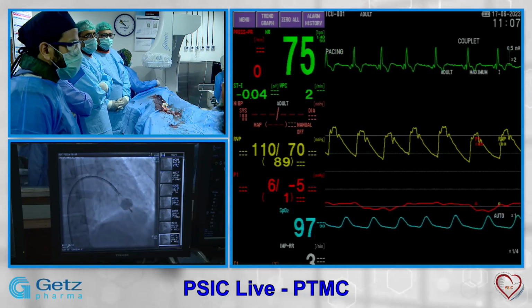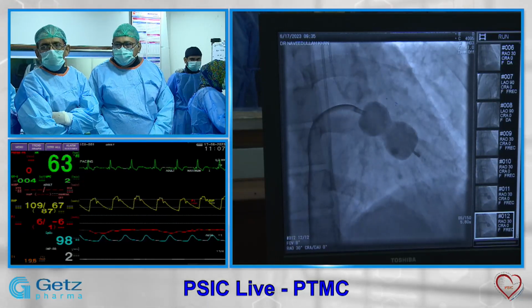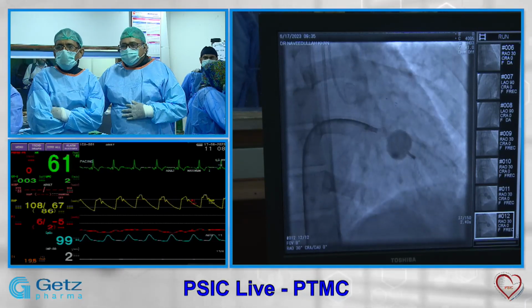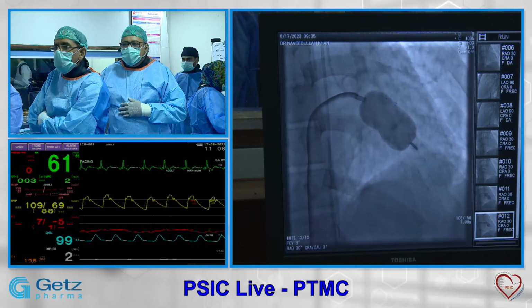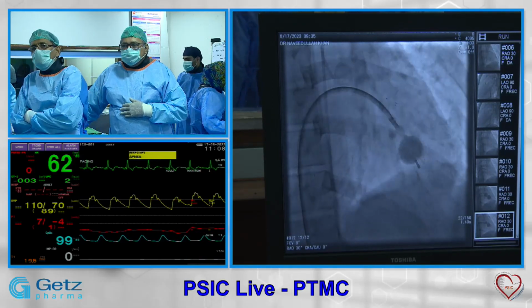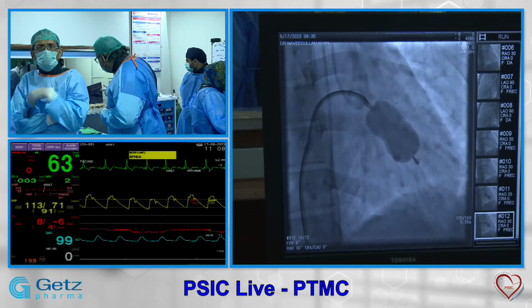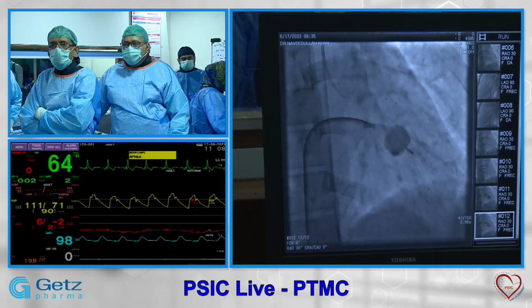Now I would like to ask our panel of experts, Dr. Ahmed Noman, can you give your experience or any question? Dr. Ahmed Noman. Yes, panelist, we can't hear you. A very complex procedure, but you have done it very well. The main step in PTMC is septal puncture, the main step.